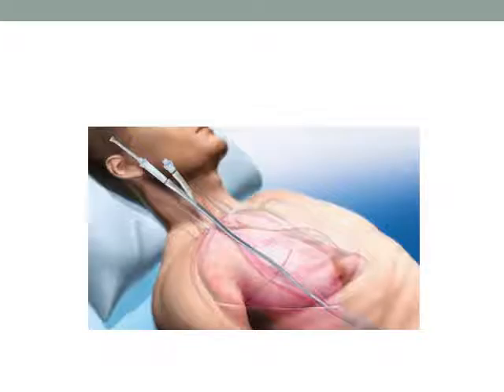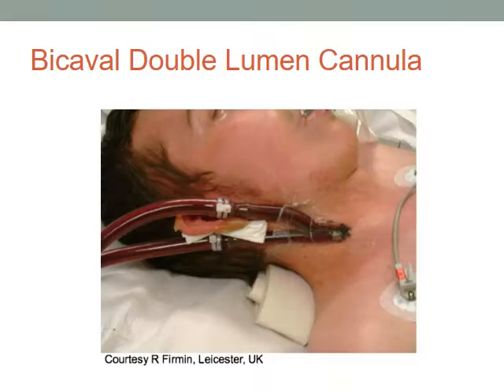This is not our patient, but looks a lot like one of ours, except for the fact that they mushed this poor person's ear. They at least recognized it and put a little piece of padding on it, but they got two ties here and they just mushed that poor person's ear. So that's not us.